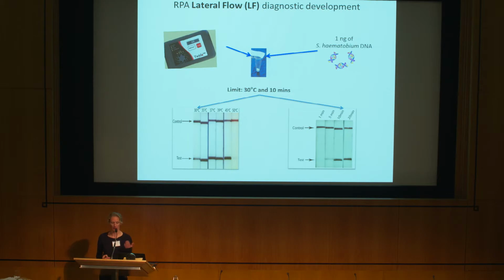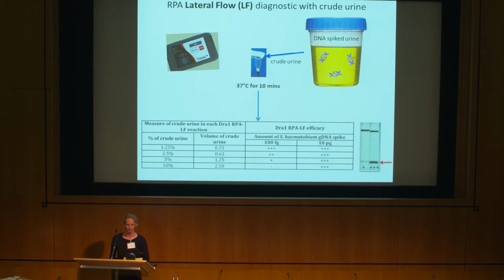We then started testing different times and different temperatures of the assay, and actually the assay worked down at 30 degrees, and we did get some signal after 5 minutes of incubation, but it worked best at 10 minutes. So again, some of those reaction times will start to be reduced. And even if we're thinking about an endemic area, some of these countries are 30 plus degrees just in the natural air temperature. So some of you might not even need a heating device.